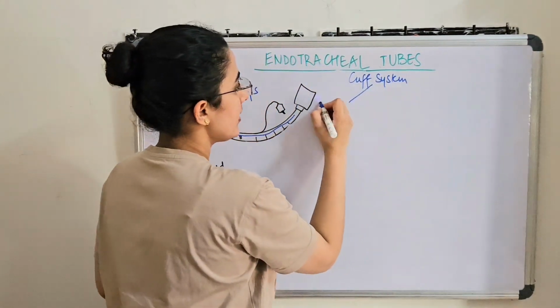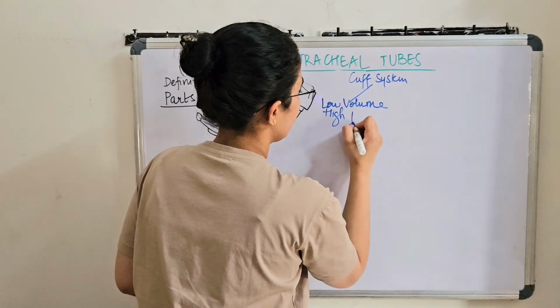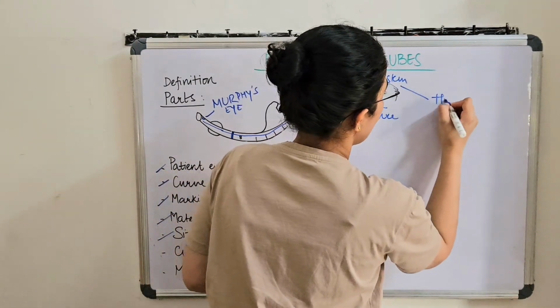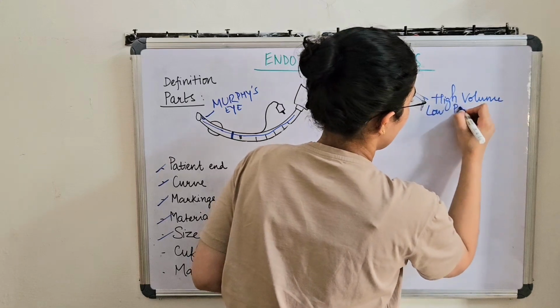Okay, one is the low volume high pressure cuff or high volume low pressure cuff.